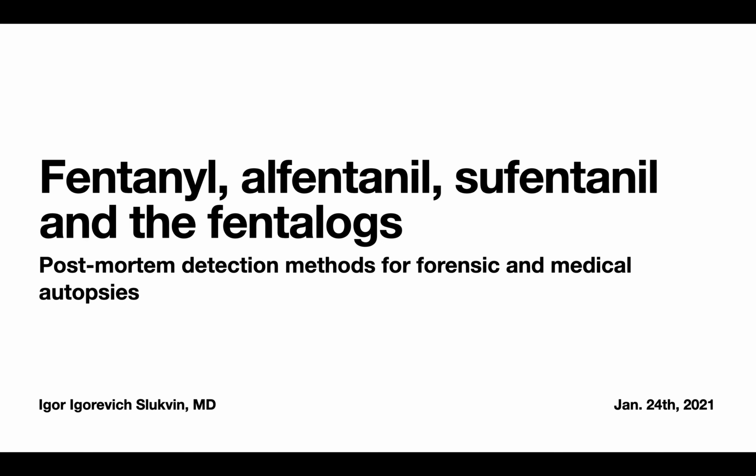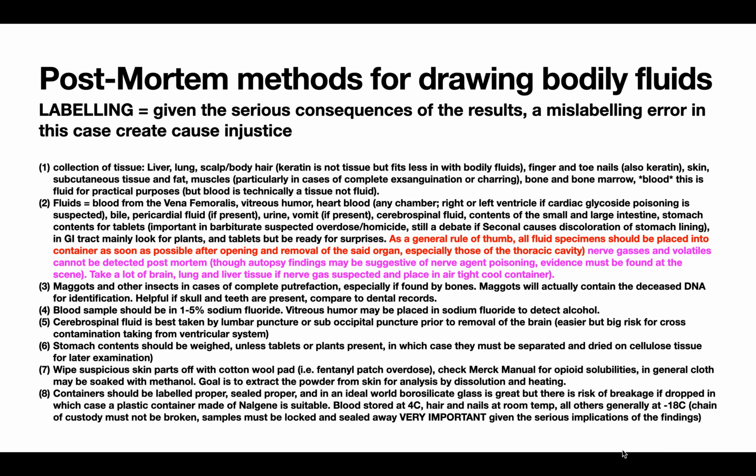This video is about post-mortem detection of fentanyl, their analogs, and sufentanil and alfentanil. Okay, so first let's start with the methods for drawing bodily fluids as well as tissue. Labeling, I have to emphasize, because of the serious consequences, it can cause injustice.